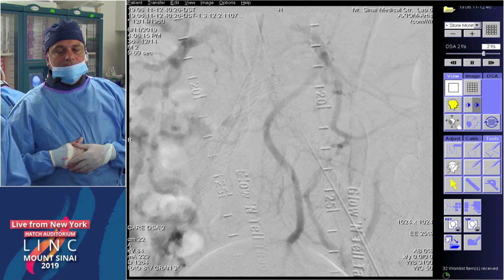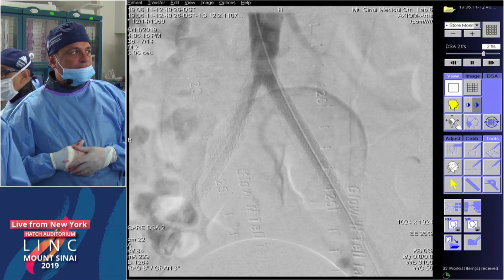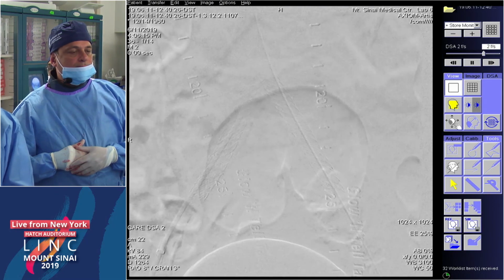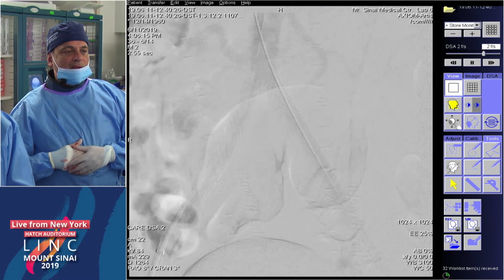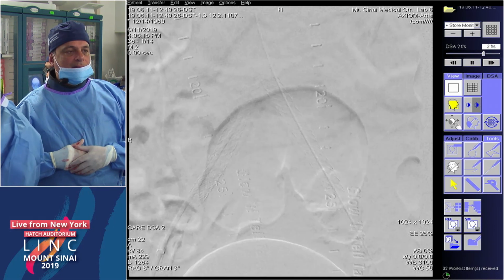And I think Dr. Tadra's question, and the other question of whether you need to use a covered stent now, or even need a stent at all, are things we have to look into more. I think we need to relook at things, and cases like this help stir the enthusiasm and ask what we should be doing and how we can make sure we do it safely and at a lower cost.